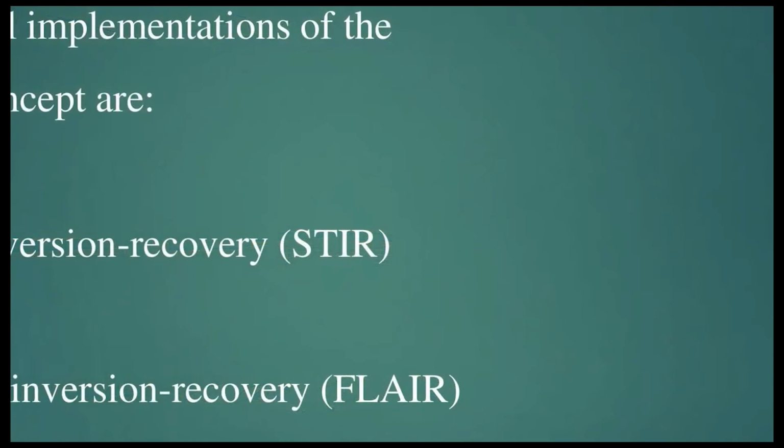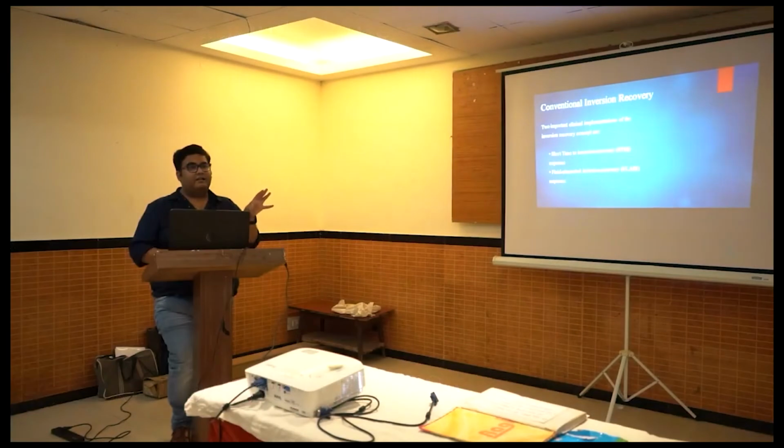Conventional inversion recovery. So if we move on from normal T1 T2 weighted images, you might have heard about STIR image and a FLAIR image. These are inversion recovery sequences. What we understand is, if there is a tissue we think is fat, we will give a signal to suppress the fat. If that lesion is suppressing in the signal, it means that tissue is fat. If we are suppressing the fluid and the signal of the lesion gets suppressed, it's a fluid containing lesion. That's how we understand and proceed.